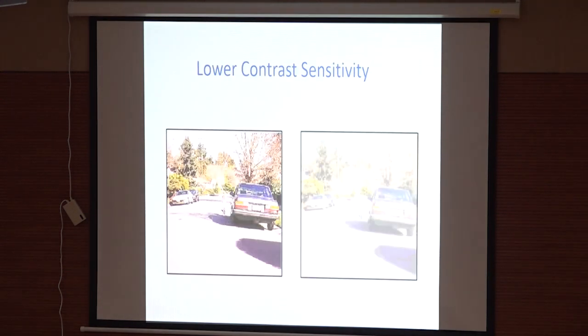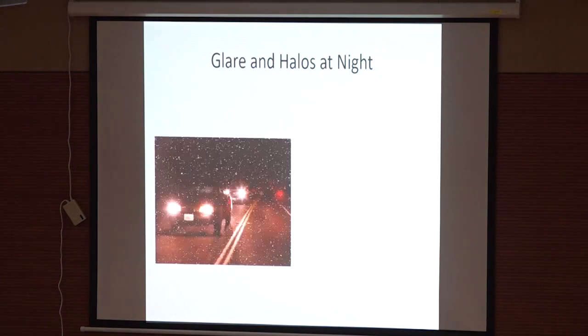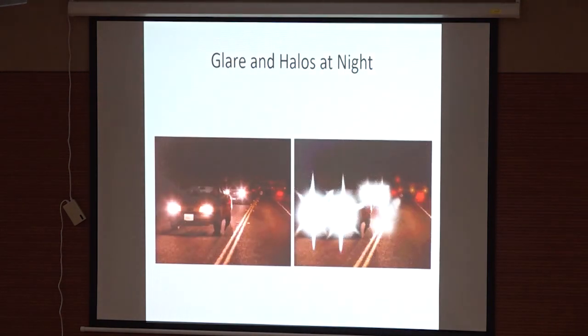And again, a very old slide, when the first generation aspheric IOLs came in, the general idea was to improve contrast sensitivity and try to balance the corneal asphericity with the negative asphericity on the monofocal IOL. And also address some of these issues, because the diffractive multifocal IOLs have been available for almost 30 years now, and most of them have had issues with nighttime driving essentially.